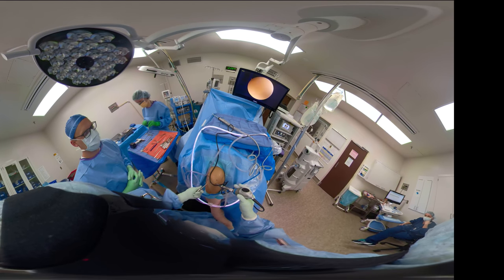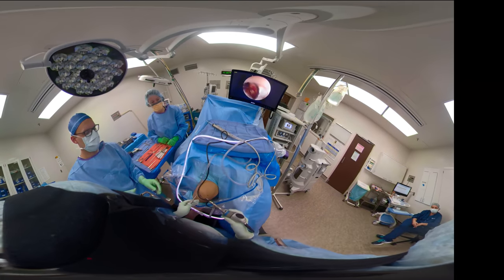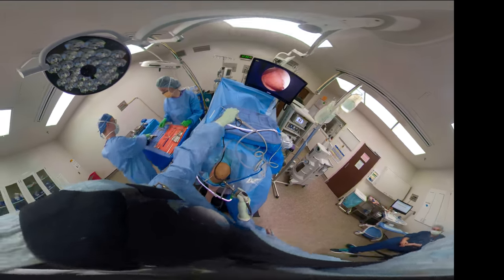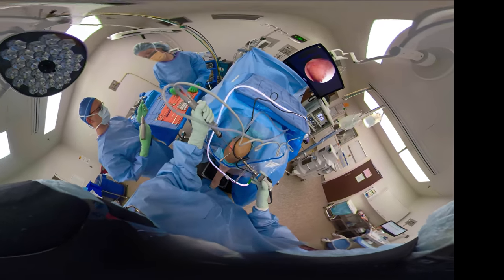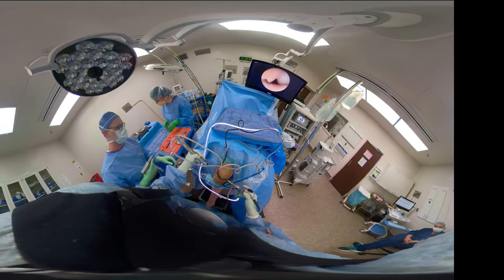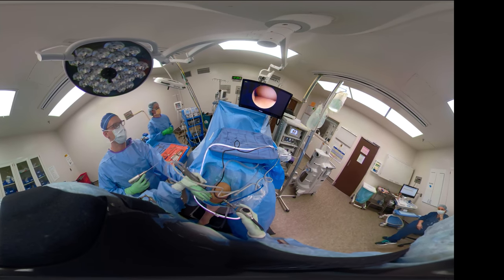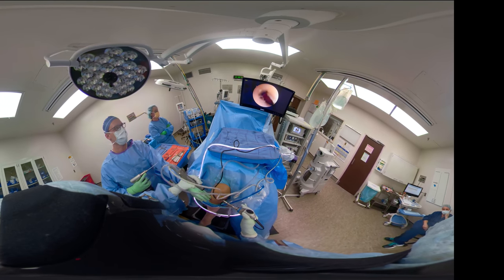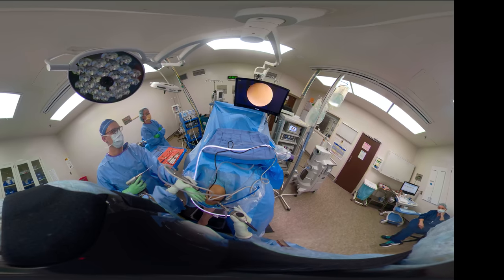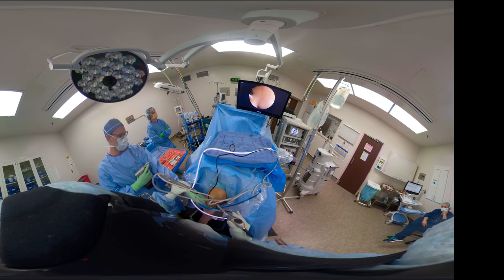Sometimes you have to come in to debride the fat from around there. So in this situation, I left the cannula in place because the fat pad was jumping on the needle, and we need to be able to see. And you can take your curved shaver and get rid of some of the fat pad. It seems like the fat pad does attack. And then I'm just debriding the fat pad around the cannula so we can get a better view.